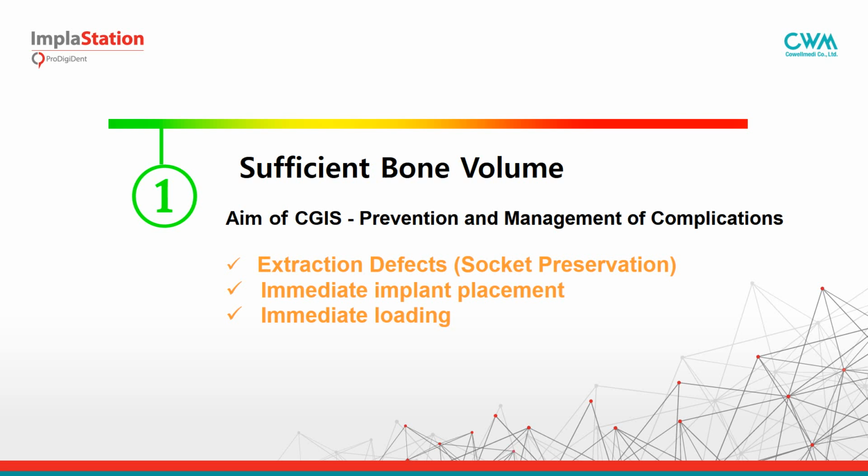Let's think about how demanded and how applicable guided surgery is for different conditions of an alveolar crest. It means available bone volume. The first, simplest situation is when we have sufficient bone volume. Some specialists believe that in this case they may easily work without guides, but what about bone non-homogeneity or immediate loading?